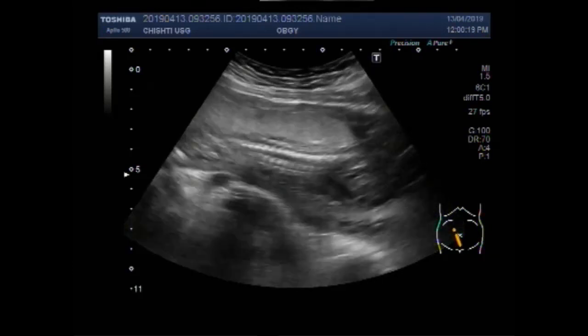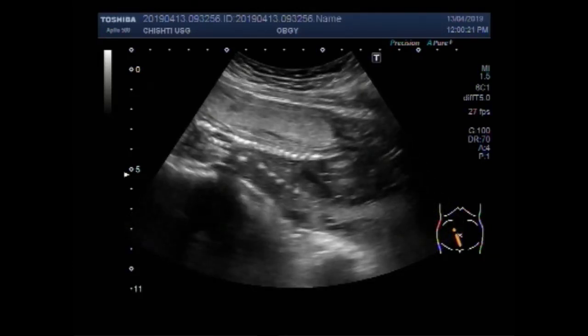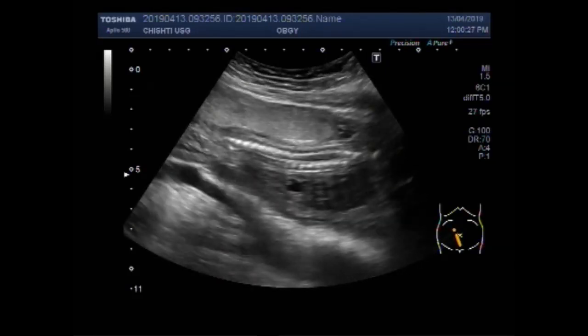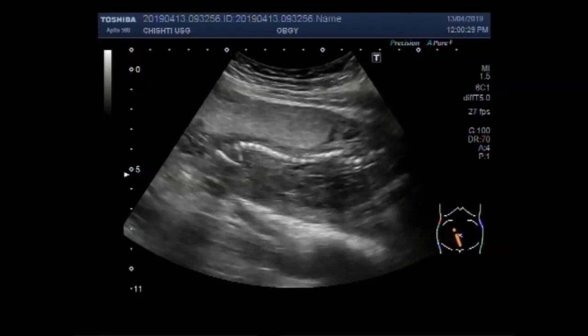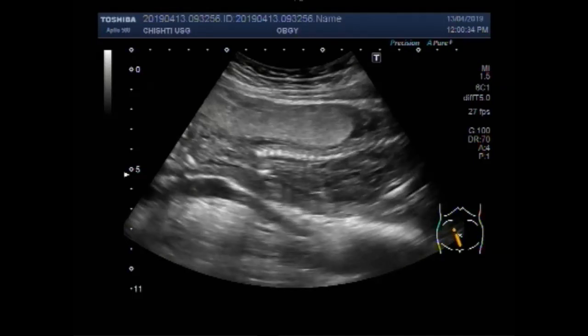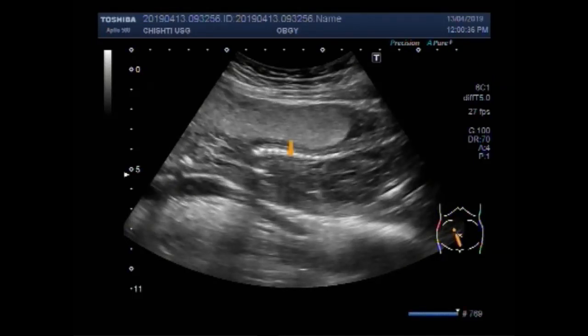You can see there is no fetal cardiac activity seen in the fetal chest cavity. This is the spine. No fetal cardiac activity is seen.